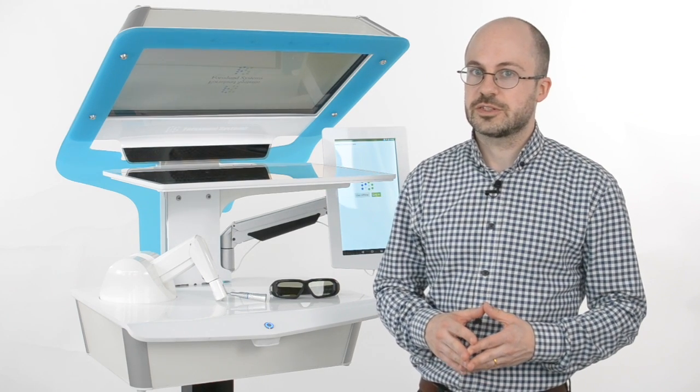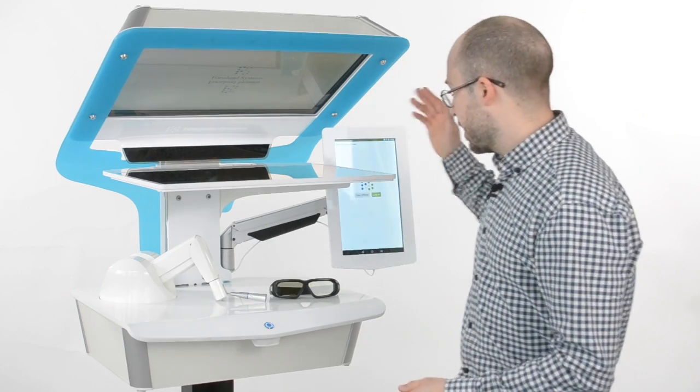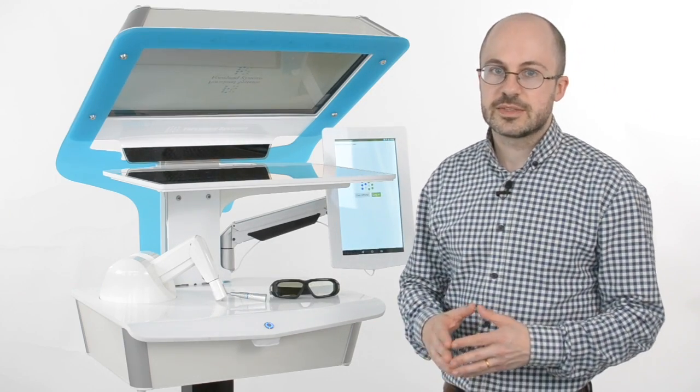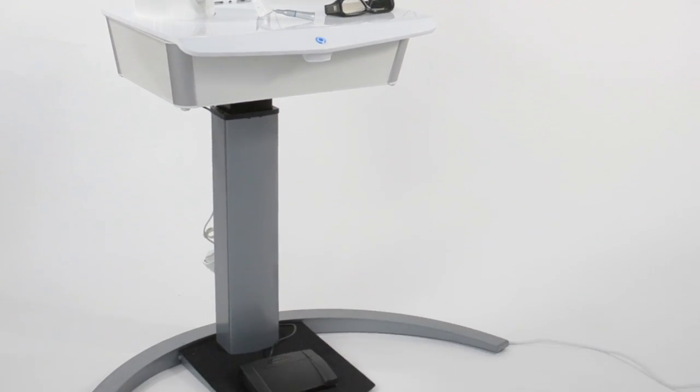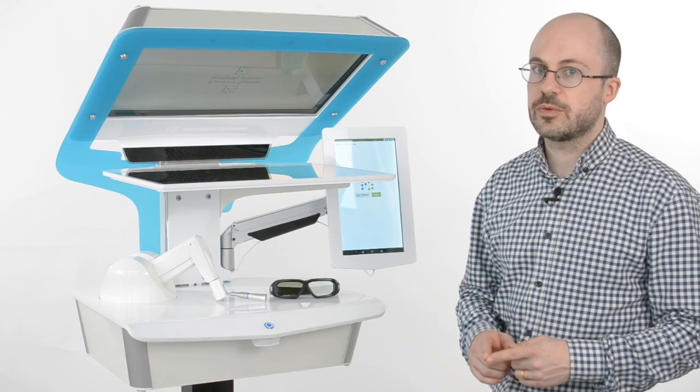So let me show you some of the features. First, we have a new enclosure designed to blend in well in a modern teaching clinic. Everything is included in one unit and only requires one power cord.